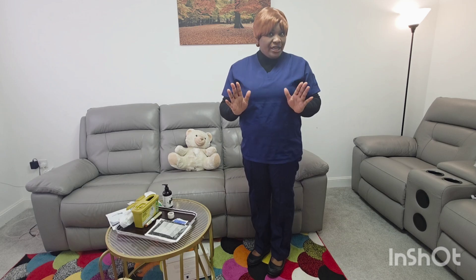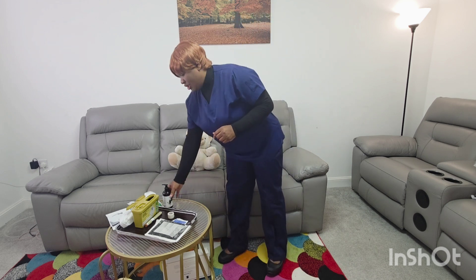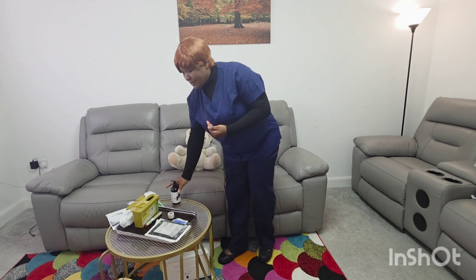Number one: scene safety. Number two: I provide privacy for my patient — you're not drawing any curtains, you just verbalize it. Number three: I will do my hand hygiene according to World Health Organization. So I put an ample amount of gel in my hands and perform all the steps — palm to palm, back of hands, interlaced, interlocked, rotation of the thumbs, tips of the fingers, wrists. My hands are clean.